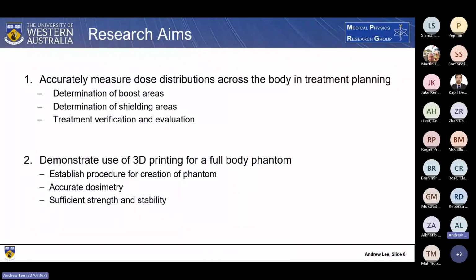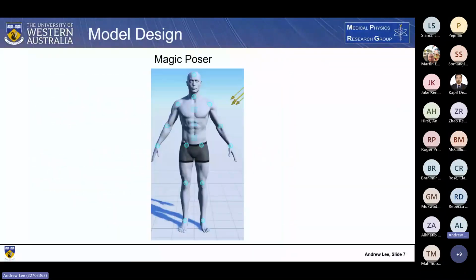And so this is going to be done with 3D printing, which we aim to establish accurate dosimetry for, and a good procedure in the case we can add patient-specific phantoms in the future. I'm going to quickly go into the model design for this project.